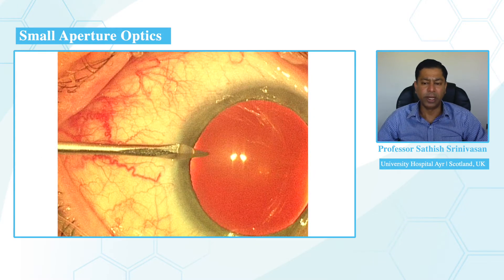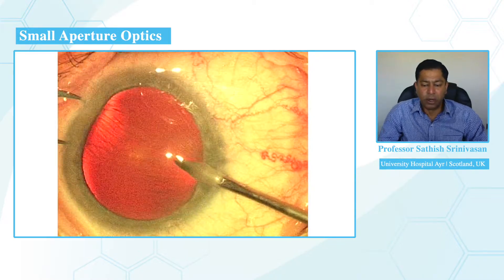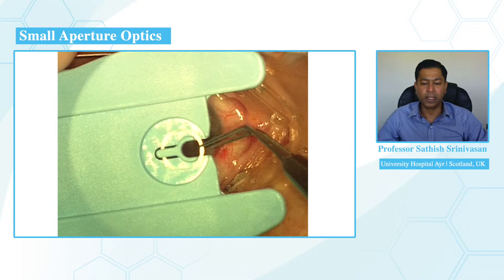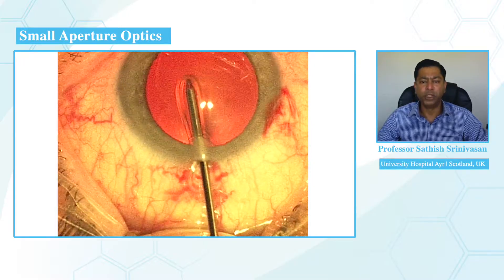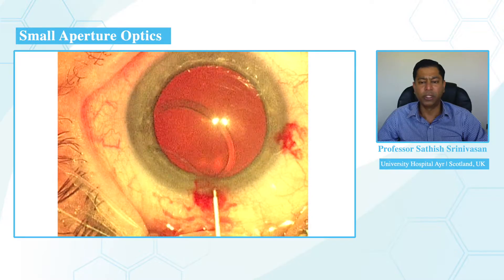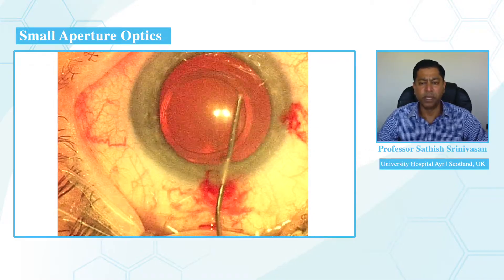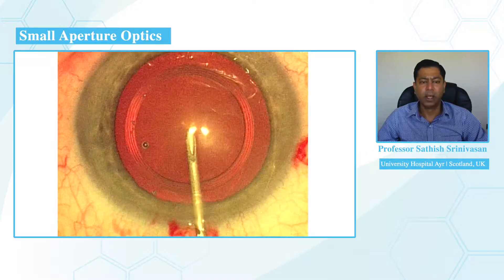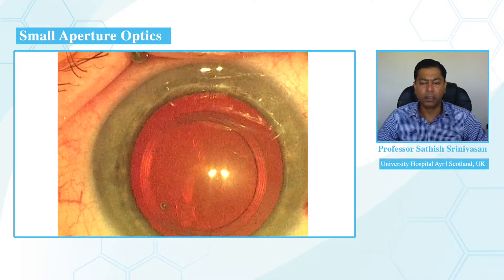This video illustrates implantation of the IC8 intraocular lens. The surgical procedure is no different from standard lens-based surgery, whether cataract surgery or refractive lens exchange. I'm using a device — a disposable silicone ring — which helps center the capsulorhexis based on the first Purkinje image from the operating microscope. This silicone ring is placed on the anterior lens surface and measures between 5.5 and 6 millimeters; in this example a 5.5 millimeter ring is used.